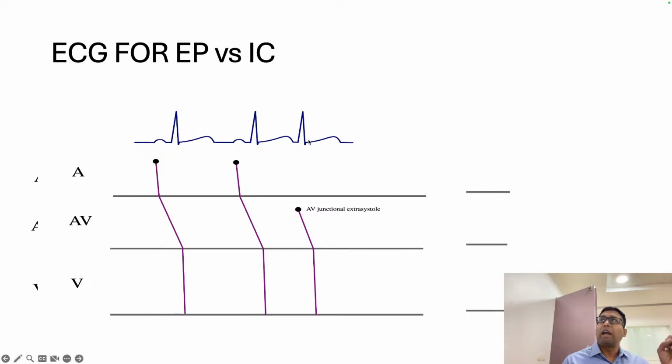So this is atrial, or it will be junctional. These are the two possibilities. Now we have to give an interpretation of where it is coming from. So first you should connect there. The QRS has started, and you have to search for a P wave. If you get a clear-cut P wave onset, you can say it is a sinus beat or an APC which has been conducted. That is one possibility. The second possibility is that there is no P wave, or the P wave is inside the QRS, which is most likely in this patient. So you can think there is a junctional beat which has been conducting down. So this is part one.